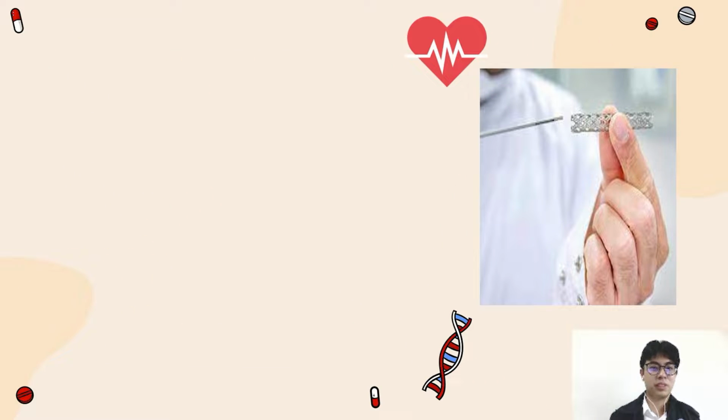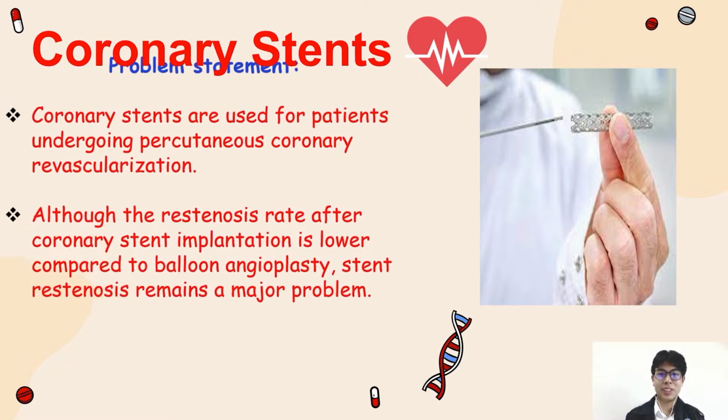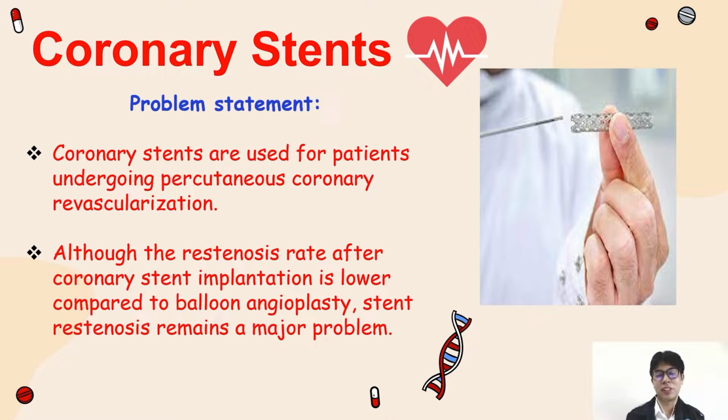Me and my friends are going to present for biomaterial case study A. Coronary stents are used for patients undergoing percutaneous coronary revascularization. Although the restenosis rate after coronary stent implantation is lower compared to balloon angioplasty, stent restenosis remains a major problem.